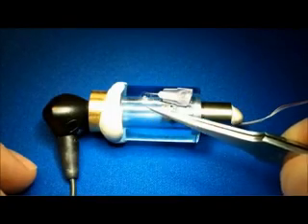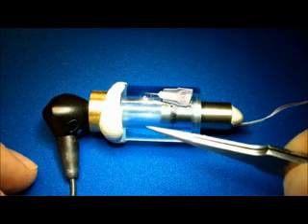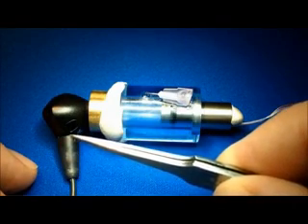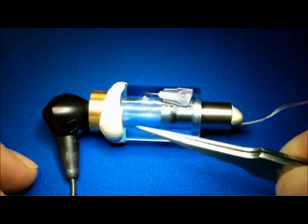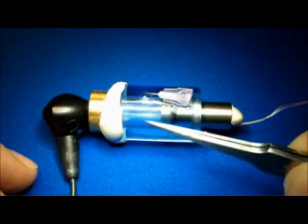Prior to testing, it's advisable to use a volume such as this, which we could call a dead ear, to confirm that our probe signal that's used to test the volume and our excitation signal that's used to excite the Stapedius reflex, that these two signals do not interact with each other. And we'll be looking at that now.